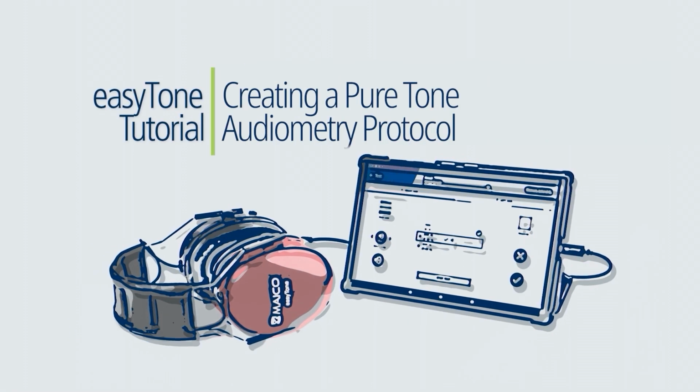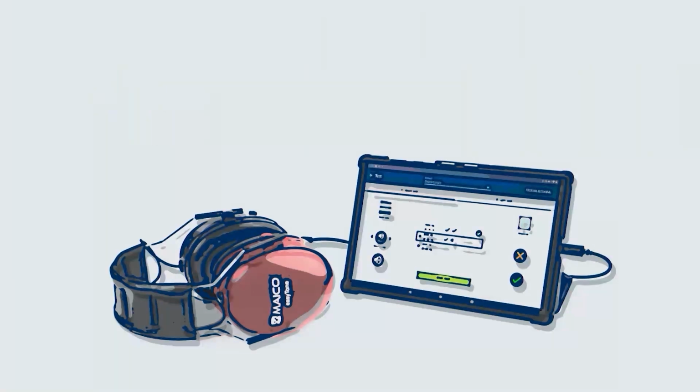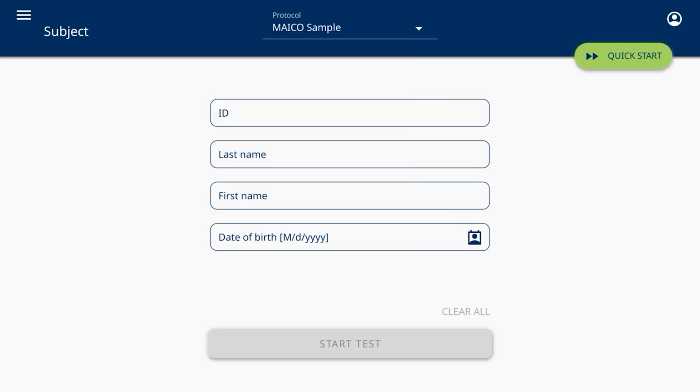This tutorial is to review creation of a pure tone audiometry protocol. The protocol setting guides the user through the protocol options with simple setting screens. This customizes the device to tailor it specific to the screening program.